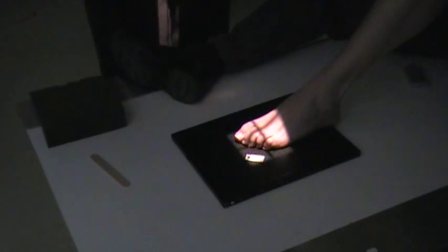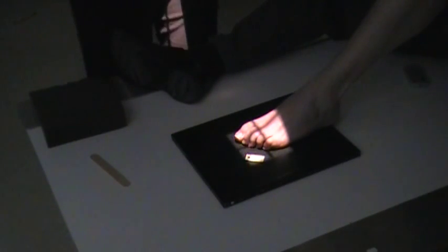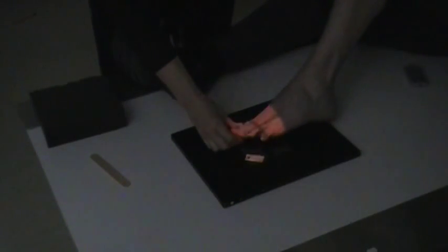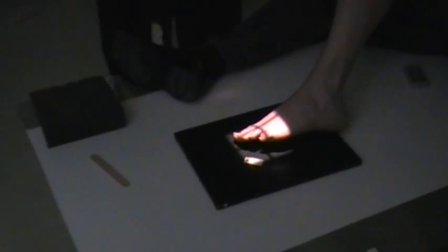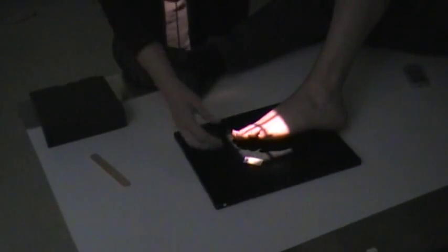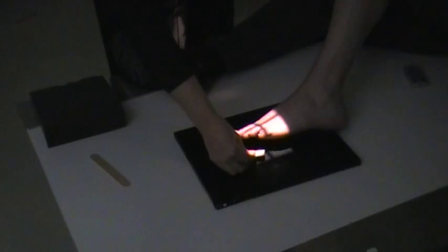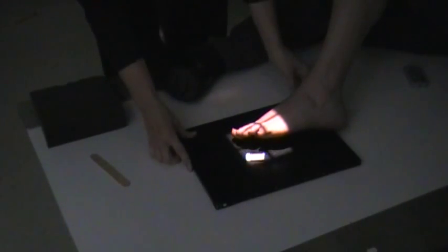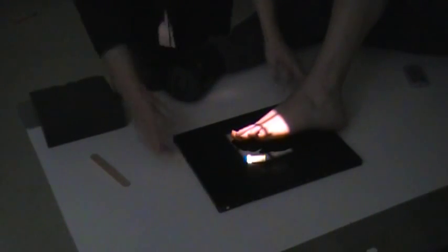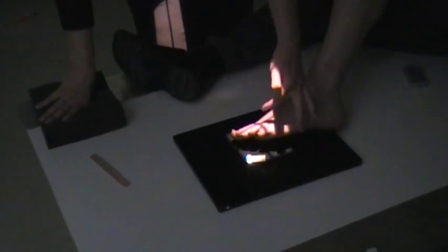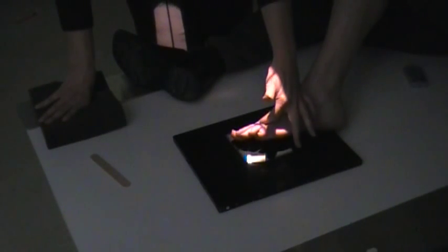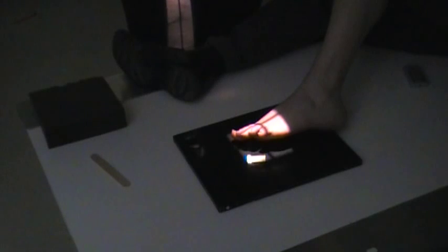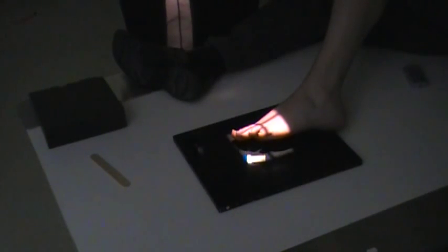For our oblique toes, we can turn the foot in medially, and we can have the foot at an angle of 30 to 45 degrees. Again, you can include all the digits on this, and our central ray is going right across the metatarsal phalangeal joint, the third one.